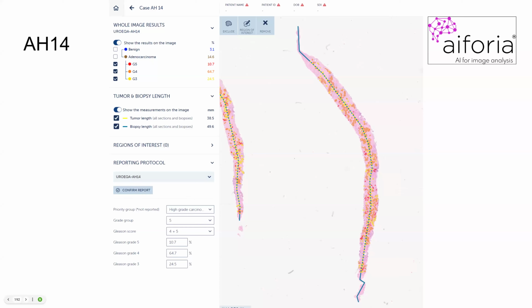Is John talking to the AI? Yeah, I'll talk to this. Here he is. So we ran this through the I4, and you'll be glad to know that it didn't really agree with us, because its overall Gleason score was 4+5, because it felt there was some pattern 5 there.